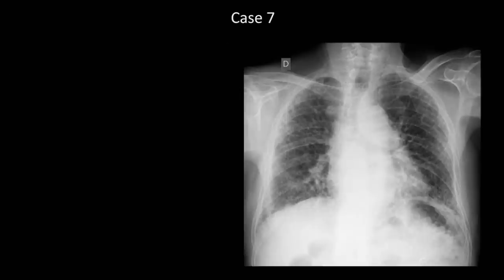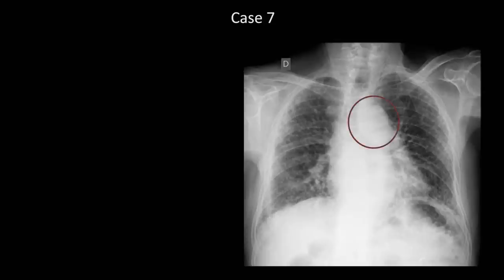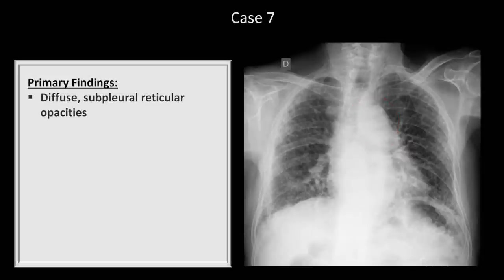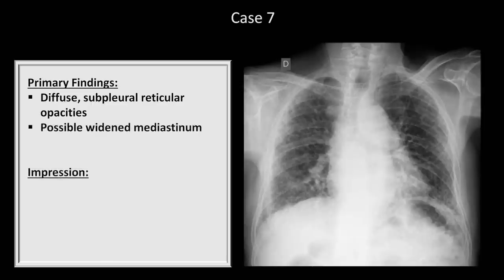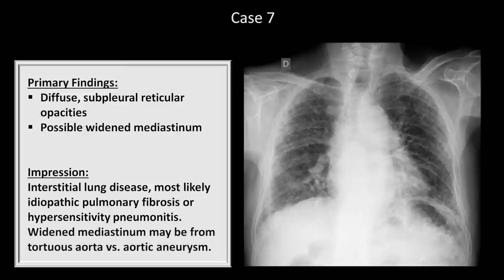Finally, there is a slightly widened mediastinum. A normal mediastinum should be less than 8 cm in width, though this number is not accurate when the patient is rotated, as this one appears to be. So we can't be sure whether the mediastinum is truly wide, although this area and its inferior extension looks a little suspicious for an aortic aneurysm or just a tortuous aorta. In summary, the primary findings are diffuse subpleural reticular opacities and a possible widened mediastinum. The impression is interstitial lung disease, most likely IPF or hypersensitivity pneumonitis, and a possibly widened mediastinum from either a tortuous aorta or mild aortic aneurysm.